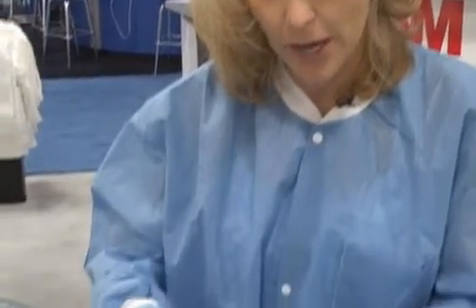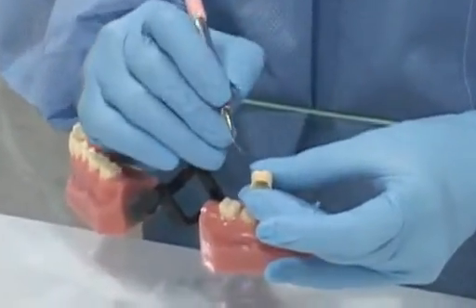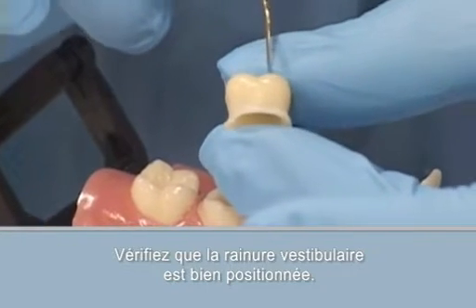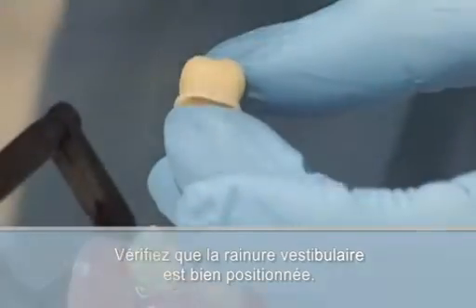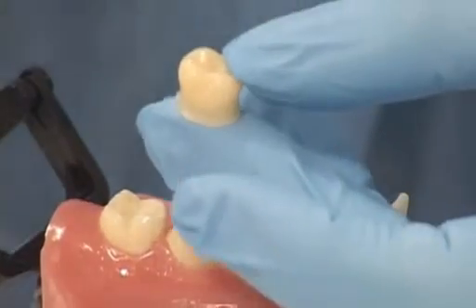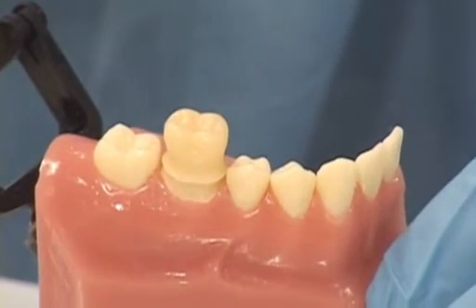One of the things that 3M has done is they've made it really easy. If you look at the crown here, I want to look at exactly where the crease is. We used to say cheek to cheek, and one of the things we always recommend is you want to see this little slit here. It's almost like butts on a bar stool, we'd hate to say, but that's basically what it is. If you turn it to the inside, there isn't a little line here. So it makes it easy for an assistant that's not certified to know, okay, this is going to go to the cheek side, not the tongue side. So if I'm looking at how that would sit on this area, it basically would sit just like that, okay?